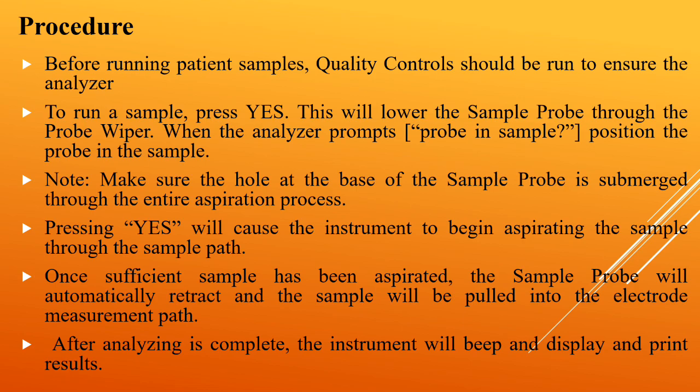When the analyzer prompts "probe in sample," position the probe in the sample. Make sure that the hole at the base of the sample probe is submerged through the entire aspiration process.